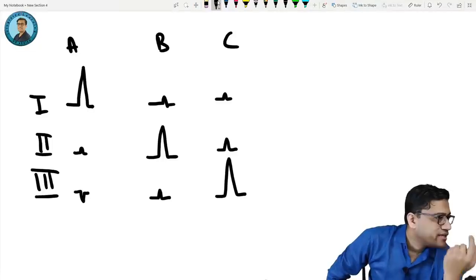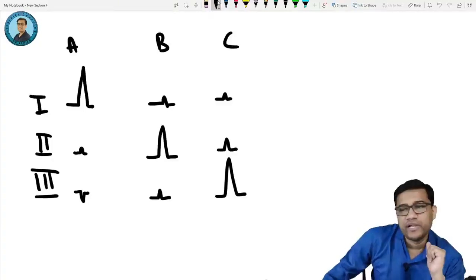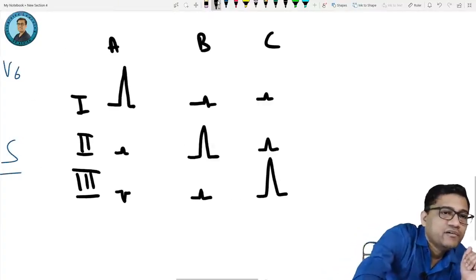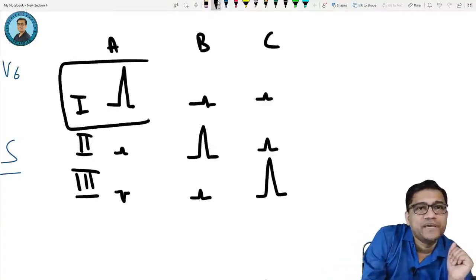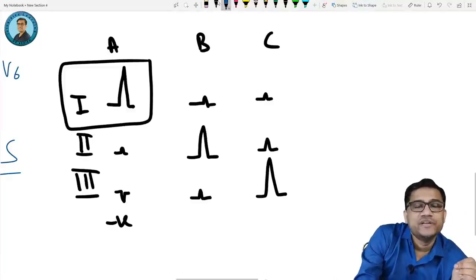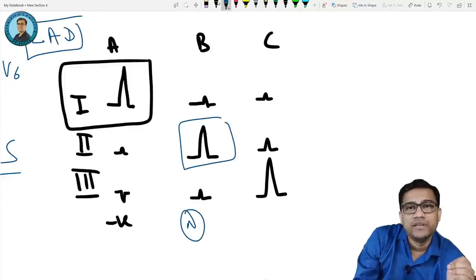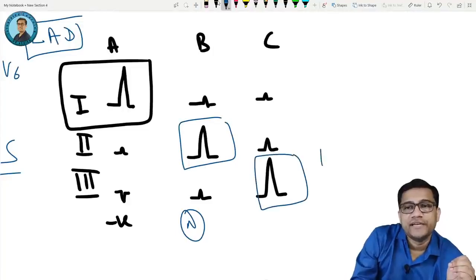Yes, Jigar, you are right, but again the answer is coming late. Okay, so everyone is able to see, so I'll write the answer here. What is bigger? R is big in 1, it is most likely negative in 3. Which one is it? Left axis deviation. Here it is big, it is normal. Here it is big, here it is right axis deviation.